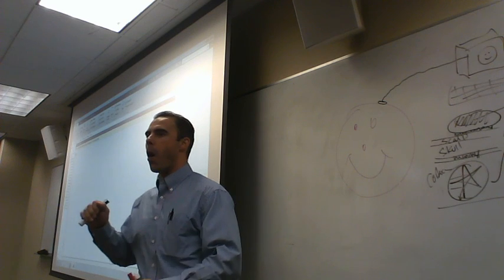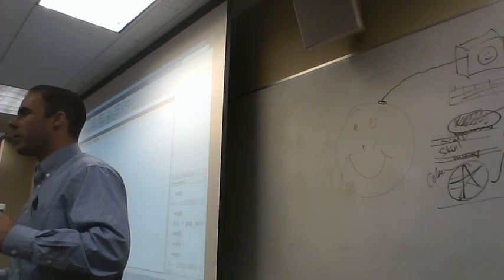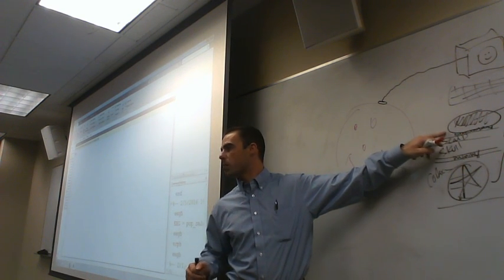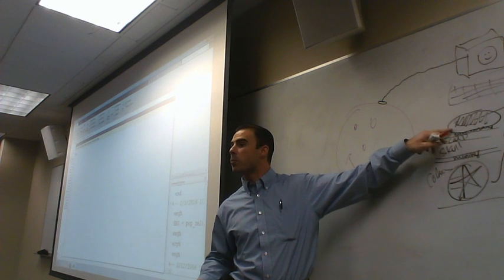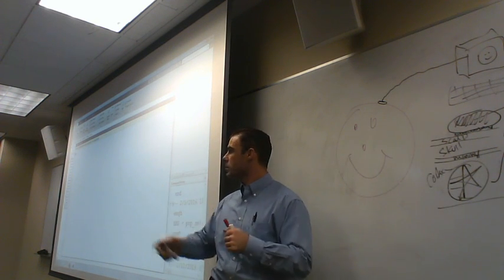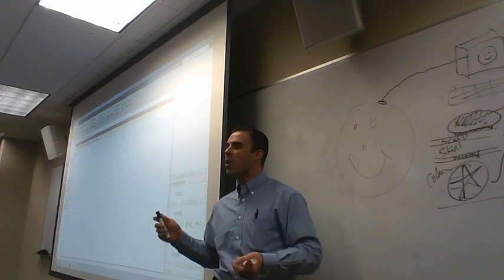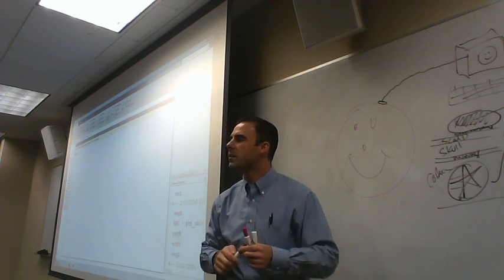It's messing up the signal and smearing it, right? And then it gets even more smeared as it comes out here. Now what's incredible is that we can still pick up and read a meaningful signal from here. But we're going to use gel, and so our saline solution gel is going to do that by virtue of the salt ions, essentially.